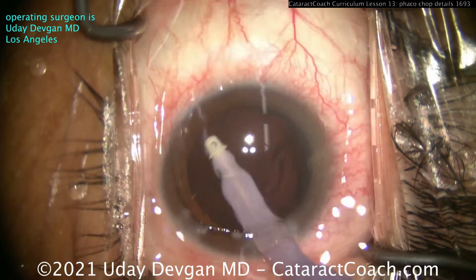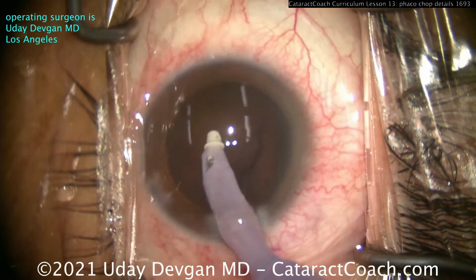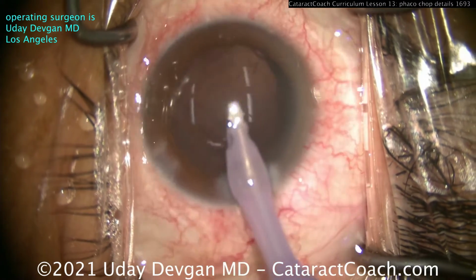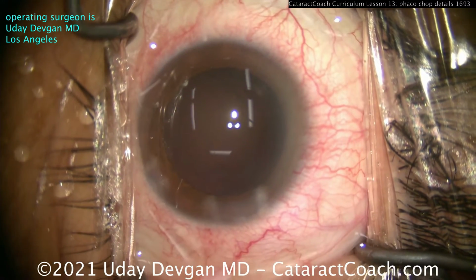And look, we can just use the IA probe to finish cleaning up. And now the case looks beautiful. So yes, for mushy cases like this, there's a reason why. If you look here on Cataract Coach, I tell you, get that nucleus out of the capsular bag. If you can get it out with hydrodissection or hydrodelineation, that's even better.